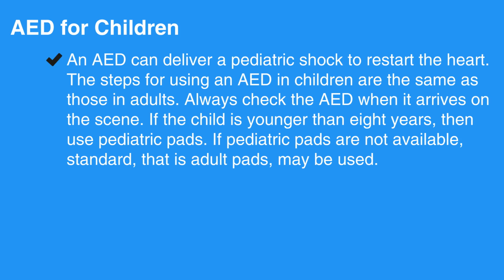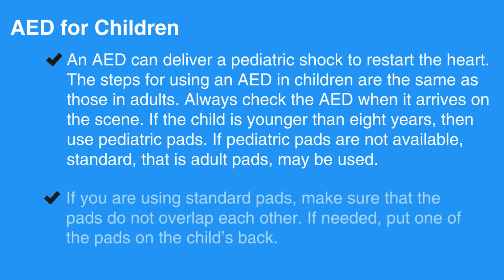If the child is younger than 8 years, then use pediatric pads. If pediatric pads are not available, standard, that is adult pads, may be used. If you are using standard pads, make sure that the pads do not overlap each other. If needed, put one of the pads on the child's back.